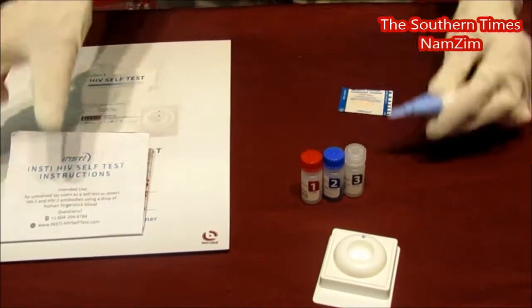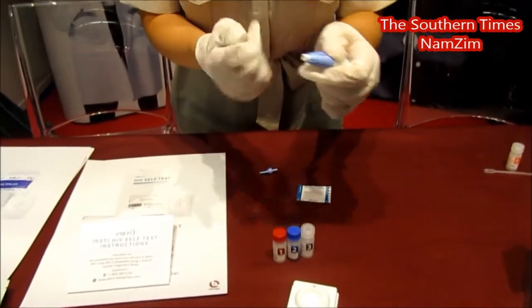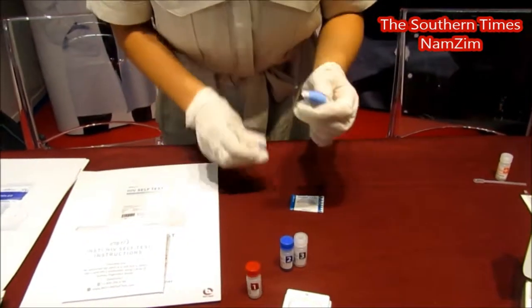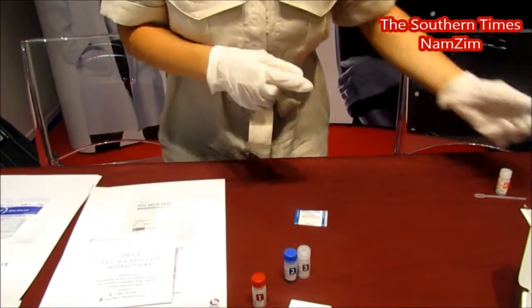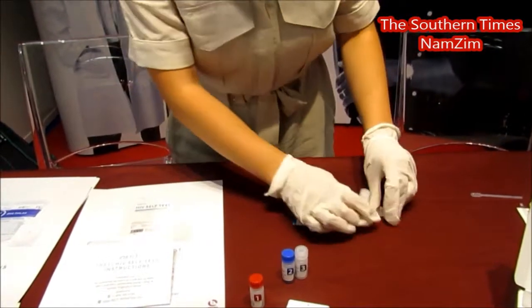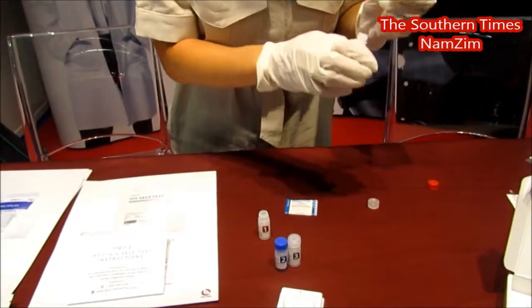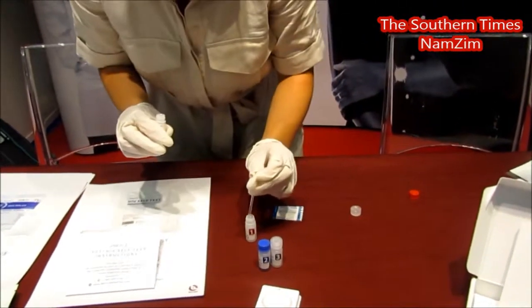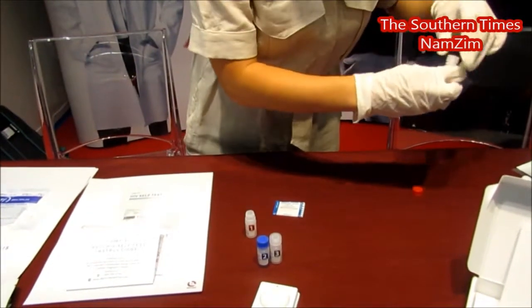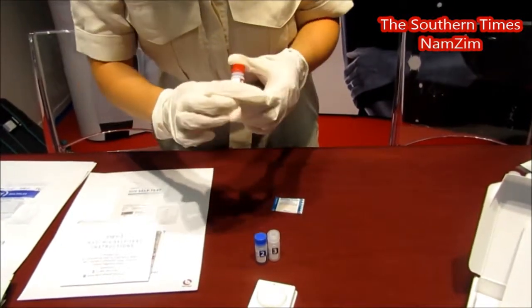So normally what you'd use is your lancet. You'd twist, and you would poke, and you would add one drop of blood free-flowing into bottle one here. But instead, I am just going to use controls. Here's our bottle one. I'll add your controls in there. This would be the same as adding blood to your bottle one.